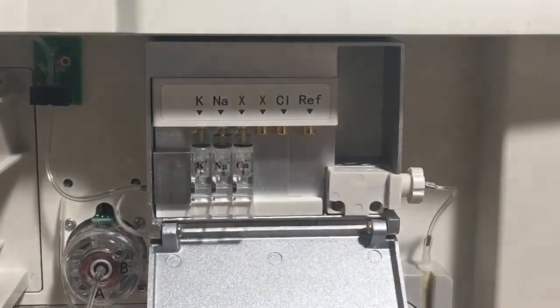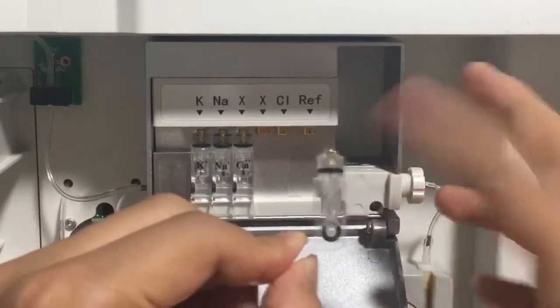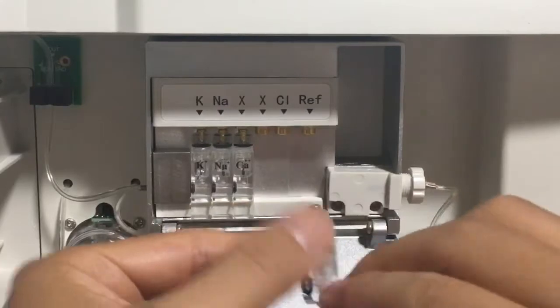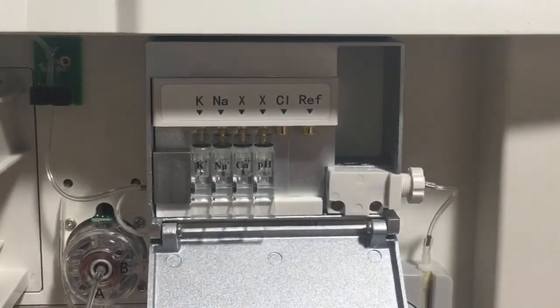When the electrode shows instability, it means there are some bubbles near the membrane.